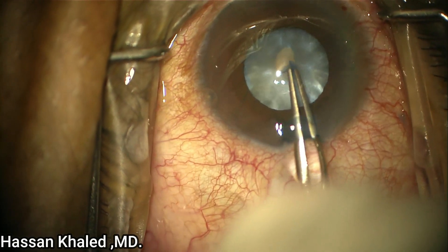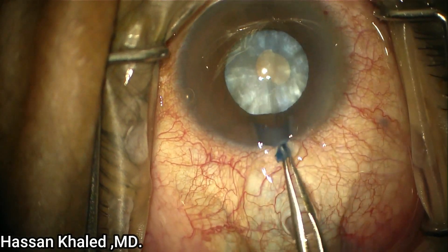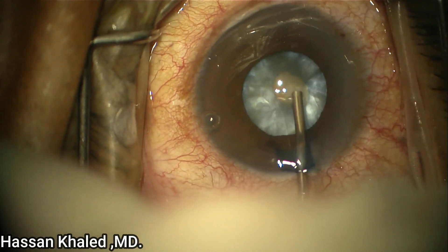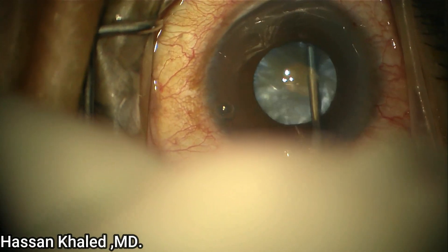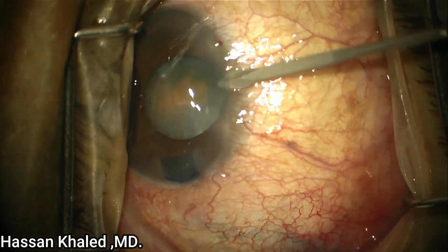Here you can see a liquefied cortex underneath the anterior capsule, so I prefer to do the double rhexis technique. Here is the small rhexis — you can see aspiration of the liquefied cortex to decompress the intralenticular pressure.